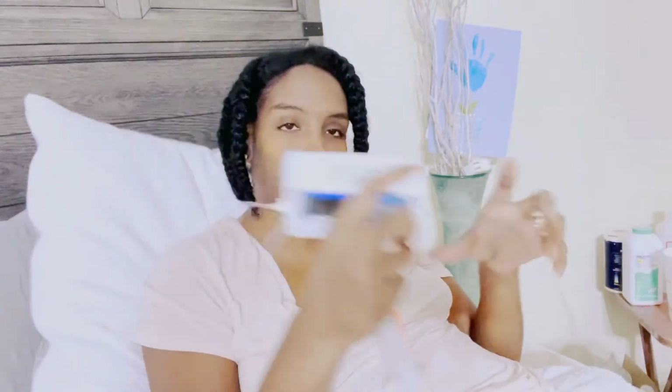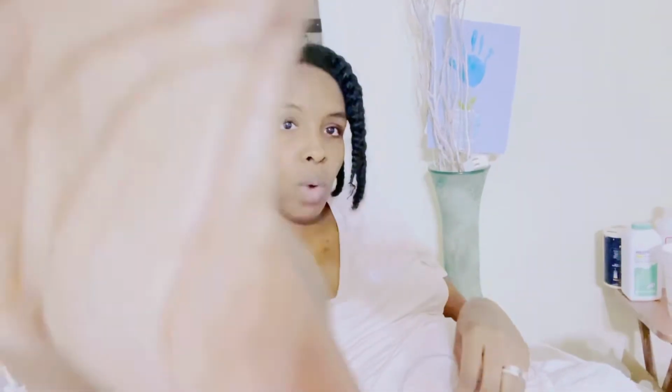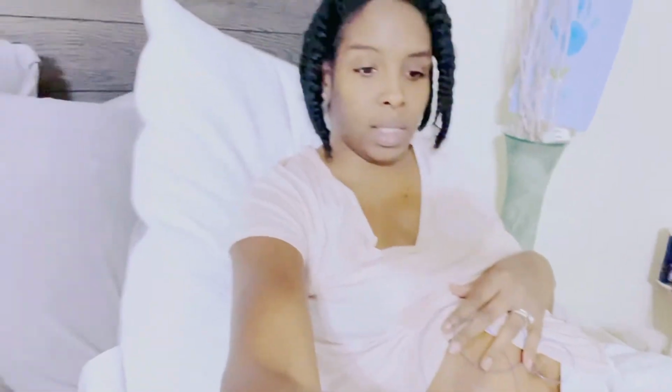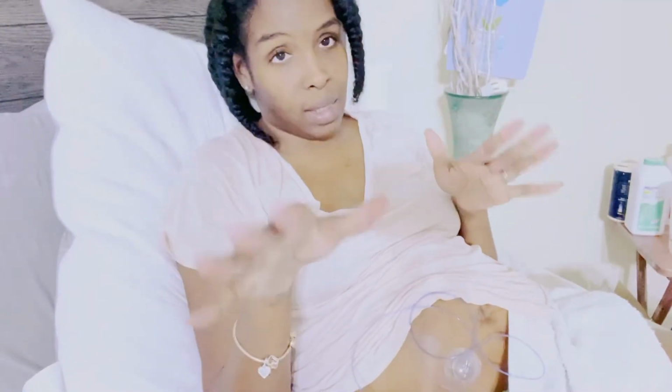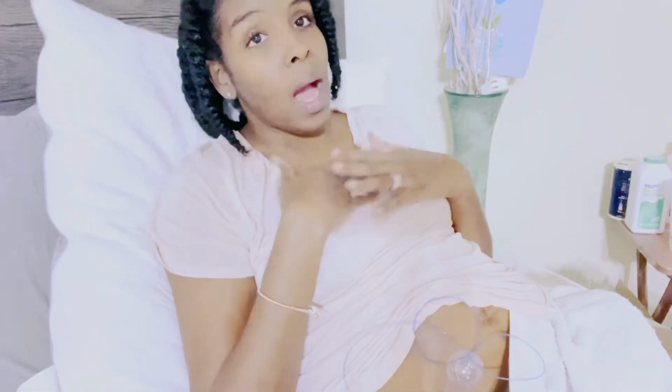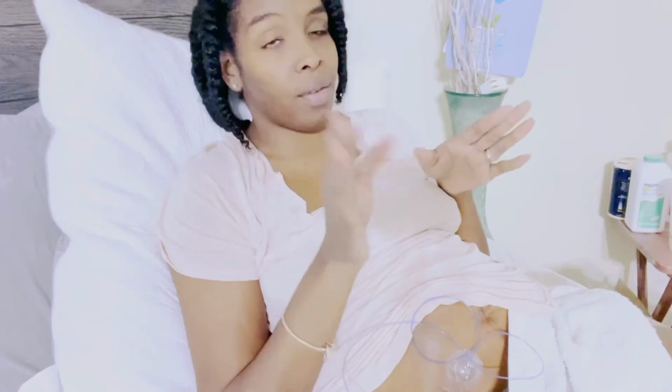Usually once a week, like Saturday or Sunday, I change this whole cord, but every other day I change this blue one here right along with the site. Really, they want you to change it every day, but they told me I can get away with changing it every other day.